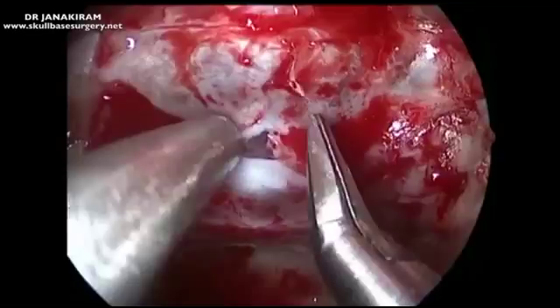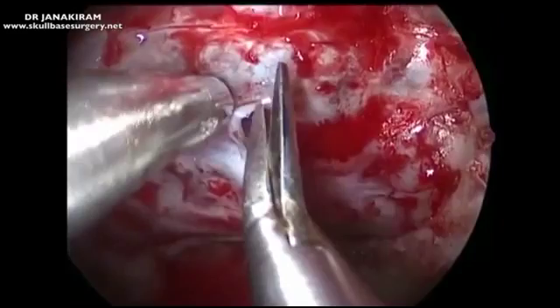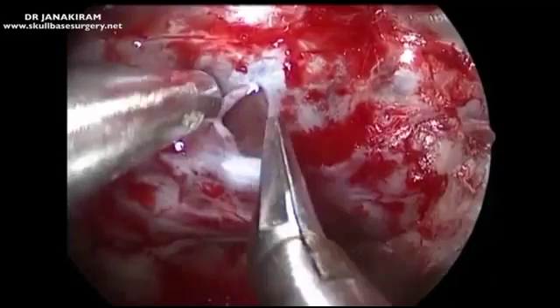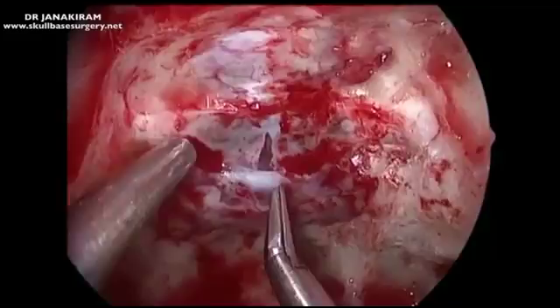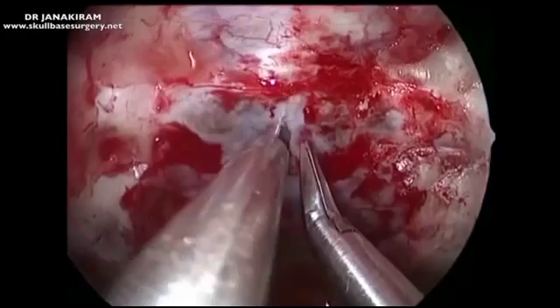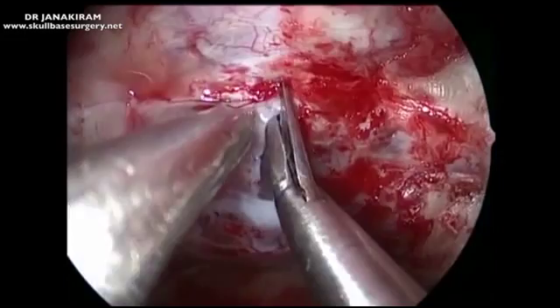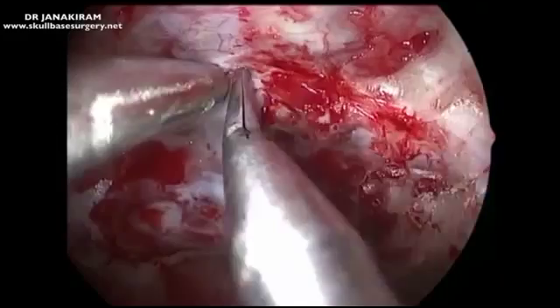You can see that I am using rotatable scissors to make a cut in the dura superiorly. See how fine and gentle the movements are — extremely important to work around the structures with no harsh movements at all. See how Dr. Shilpi is giving a brilliant view of the part which I want to see. It is a four-handed technique and you can see that I am retracting that dura. I will now be seeing inside the dura — that is the arachnoid seen very well.